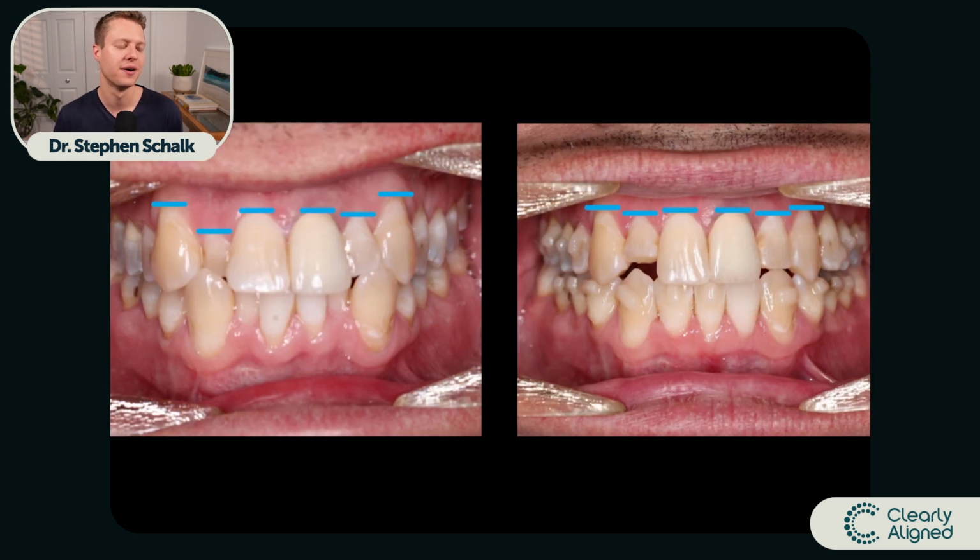And you can see here, we've aligned the gingival margins, right? We've given space for those restorations to go in place. So this is all completely intentional. We also have completed that interproximal reduction, the smoothing between those upper teeth, so that we don't end up with a giant overjet, right? We want to make sure that this patient's top teeth and bottom teeth are close together and you can't fit your entire thumb between them. So that small amount of smoothing just made sure that the bite fits together properly, right?